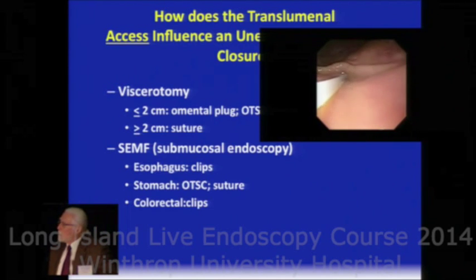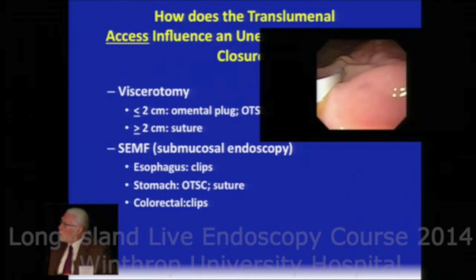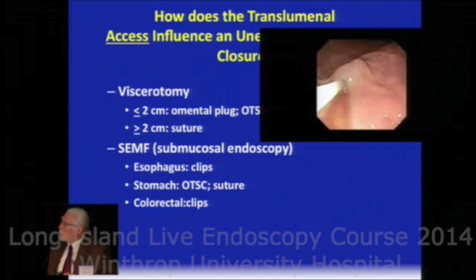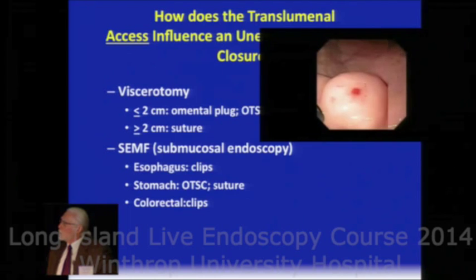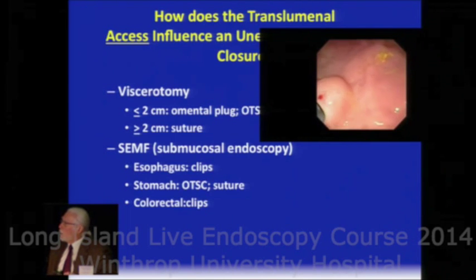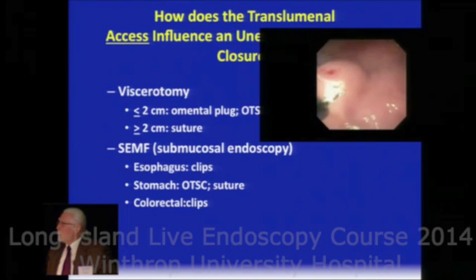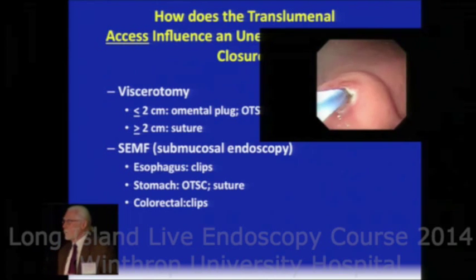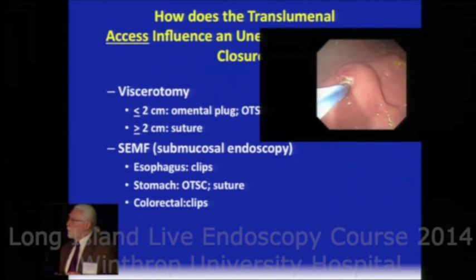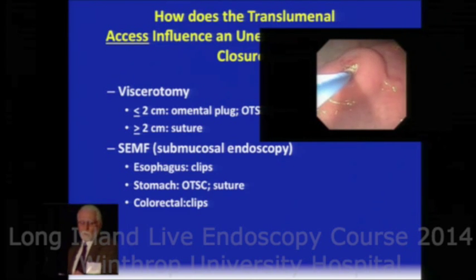In the esophagus, clips work very, very nicely because, in effect, as you watch this video, we're going to create a tunnel, in this particular case, that's about 10 centimeters long. And as you watch this tunnel eventually crossing the greater curvature of the stomach, that overlying mucosa is a perfect Band-Aid. We've actually studied this in the lab. You really don't even need to close the opening of this tunnel in locations like the esophagus and even the colon. Stomach's a different story because as you look here, the mucosa is thick.